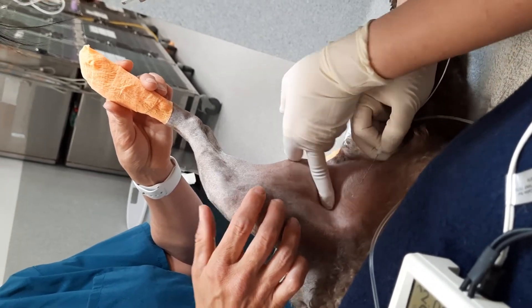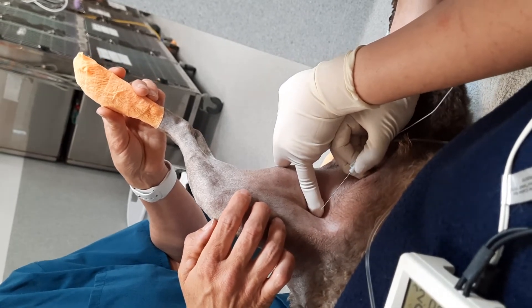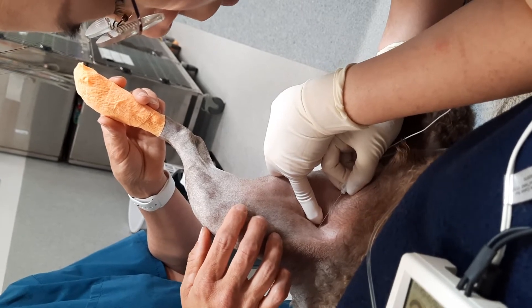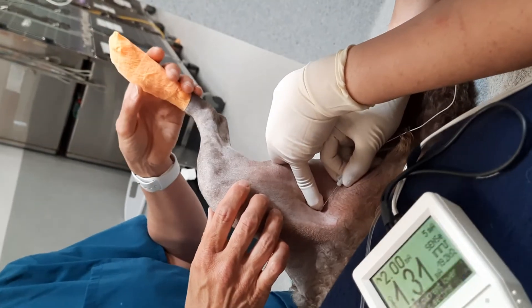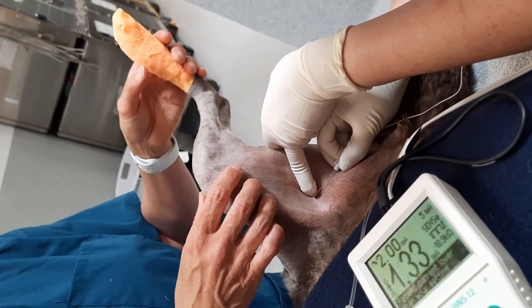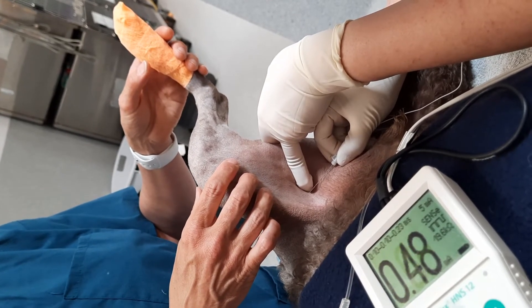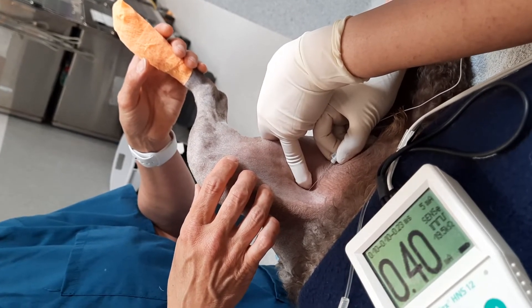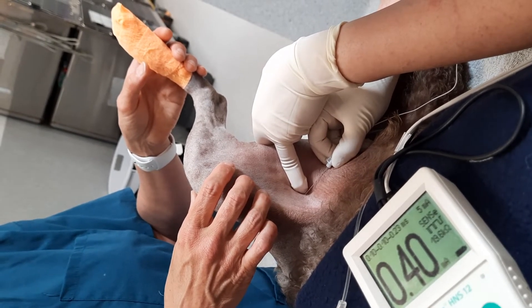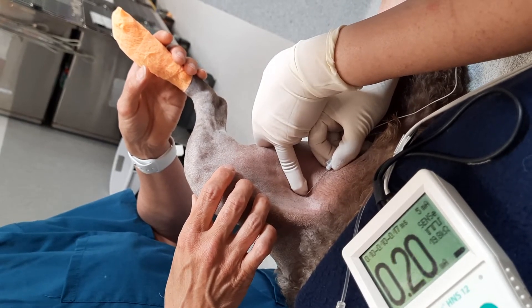When I push the pectineus muscles caudally, I'm trying to avoid the femoral nerve and vessels. I'll insert the needle perpendicular to the skin again. That's the amount of stimulation we're looking for at 2 mA. We'll slowly decrease it to 0.4, making sure that there is still stimulation at 0.4. We can still see muscle twitching there, so that's good. We'll decrease it to 0.2 to make sure that we're not within the nerve.